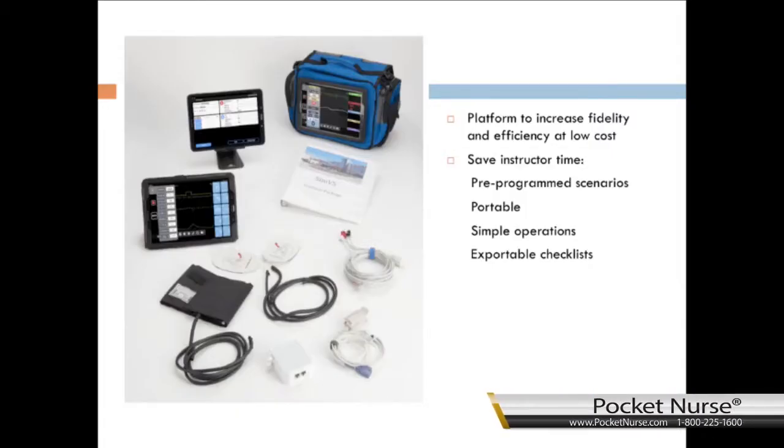SimVS has been designed as a comprehensive platform to allow instructors to increase the fidelity of their simulations and also to provide efficient simulation operations at a low cost. The way the scenario saves instructors time is through a library of pre-programmed scenarios, validated as well. The system is portable, easily set up, allowing for simple operations through either the pre-programmed scenarios or on the fly. For debriefing, the scenario allows you to capture performance while the scenario is playing and export the checklist to be used in debriefing. Let's take a look at some of the other features.